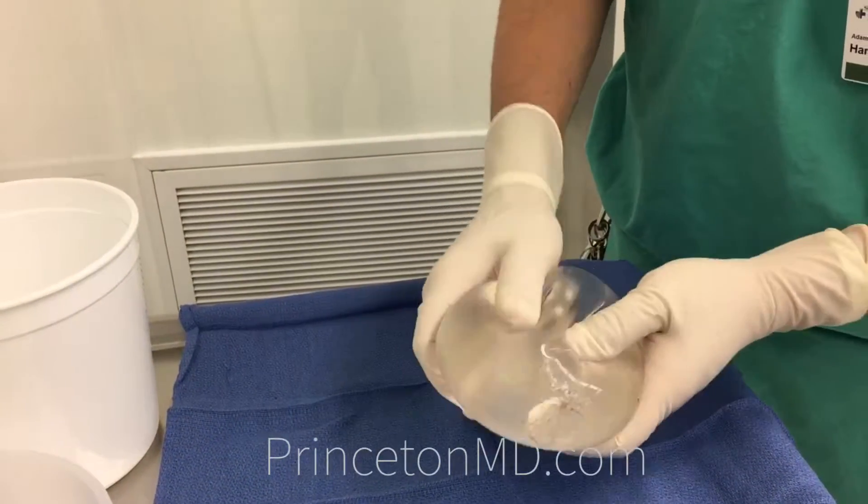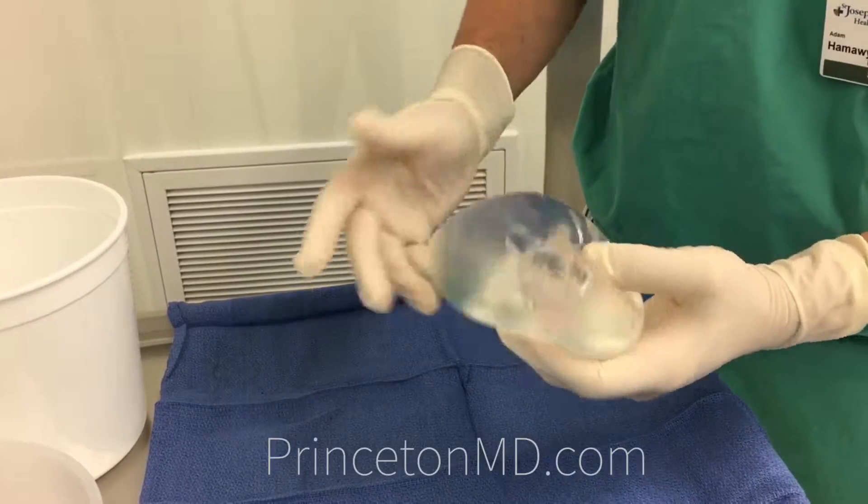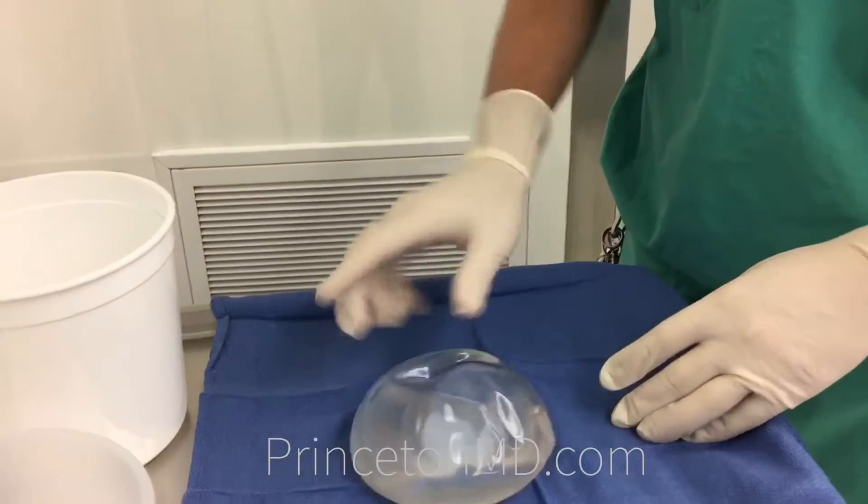Took it out, didn't have to do much cleanup. Squeeze as much as you can there and it all pops back in. So silicone gel implant.